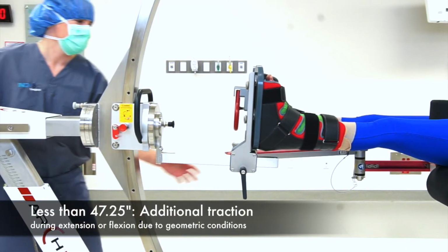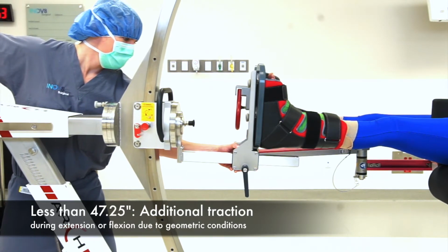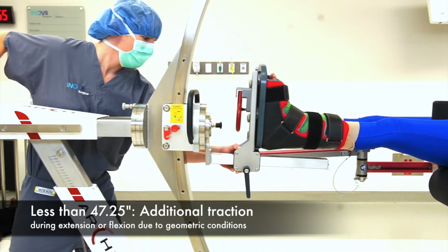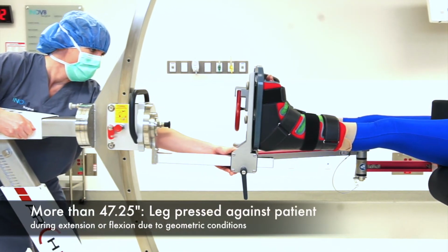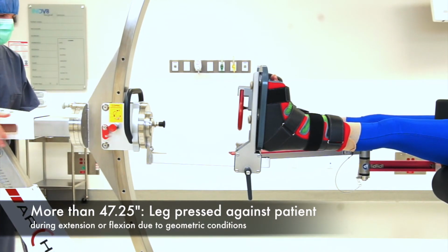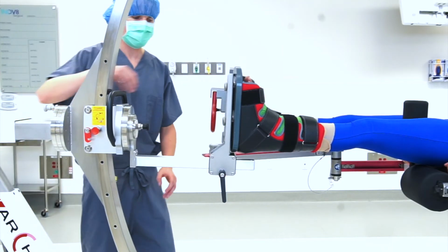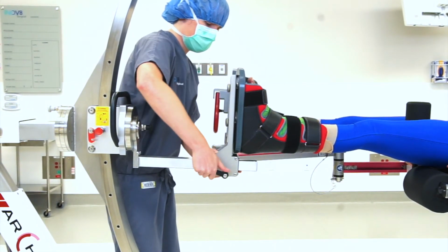If the arch is too close to the OR table, additional tension is exerted on the leg during extension or flexion, which could result in greater traction of the leg. If the arch is too far from the OR table, the leg is pressed against the patient during extension or flexion, which could cause knee bending. After positioning at the correct distance, tighten the clamping lever. There is no need to loosen this lever during the procedure, due to the constant traction design of the arch.